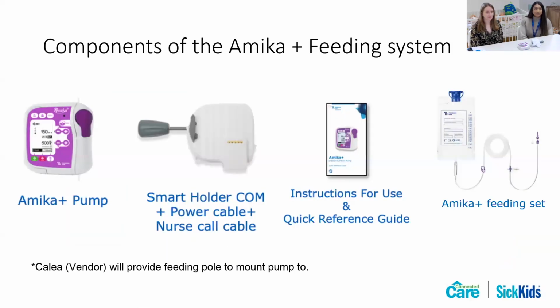All right, so just to cover the components of the Amika Plus feeding system, one is primarily the Amika Plus pump here. The second is the smart holder that comes with the pump. The smart holder should be mounted onto a pole. This can be a feeding pole, an IV pole, or even a pole on the wheelchair. We want to make sure that it is firmly placed on the pole. You do that with this back piece right here, where you can loosen and tighten the clamp to mount it on the pole. Another thing to note is that the clamp is rotatable, so it can be adjusted in position as needed.